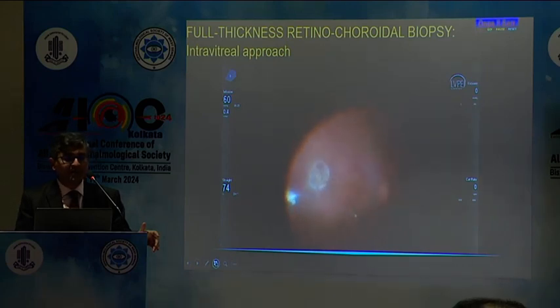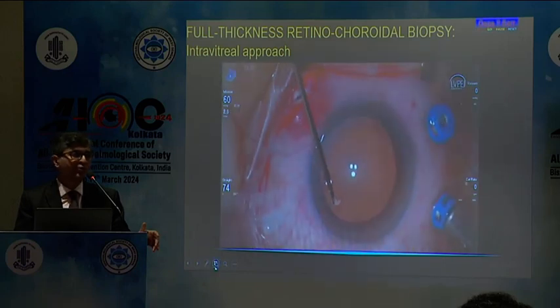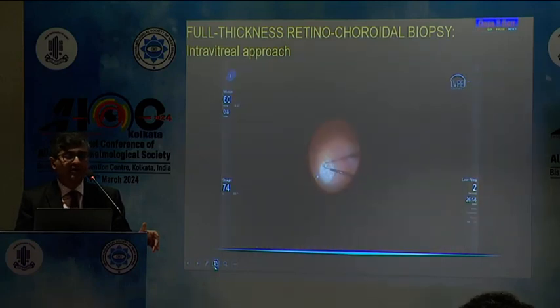So you can see that even if your multiple vitreous attempts or biopsies have come back negative, if your clinical suspicion is very high and the patient is not responding to your treatment, I think you need to devise an approach which is appropriate for that patient, and ultimately you do laser all around and you close the case under air.